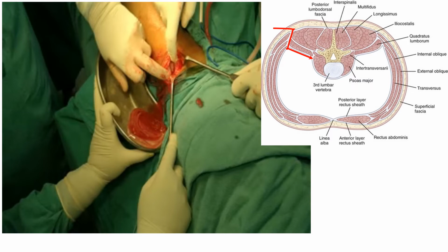Then you break all the loculi, irrigate with saline and hydrogen peroxide, put in a sponge and pack for hemostasis, close the muscle layer, the subcutaneous tissue, and the skin, and dress the wound. And that's how you drain a psoas abscess.